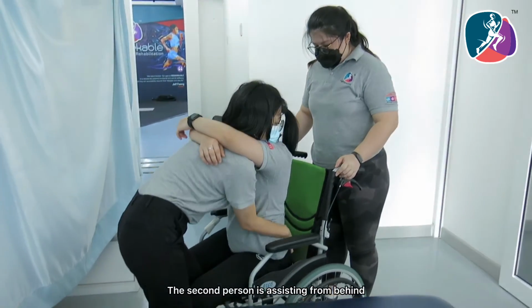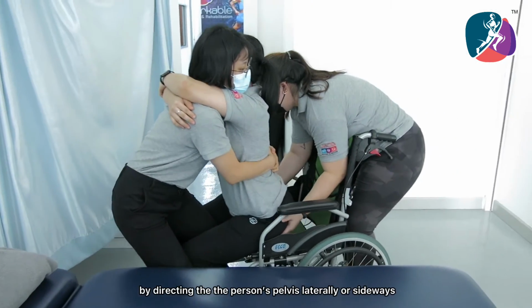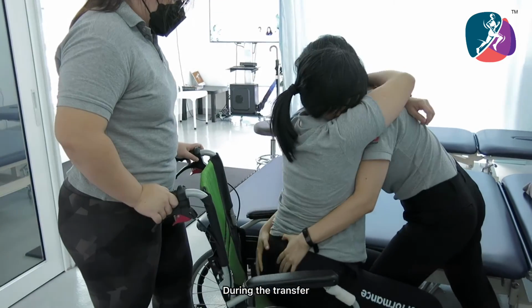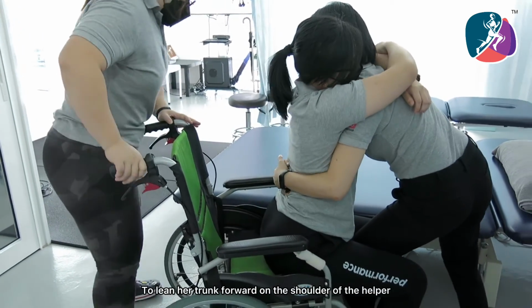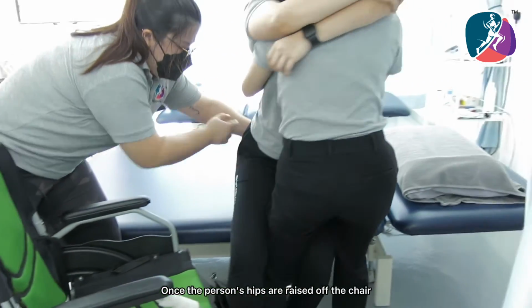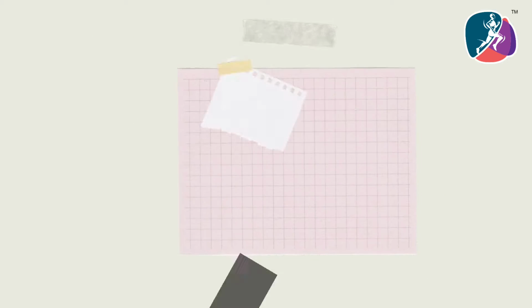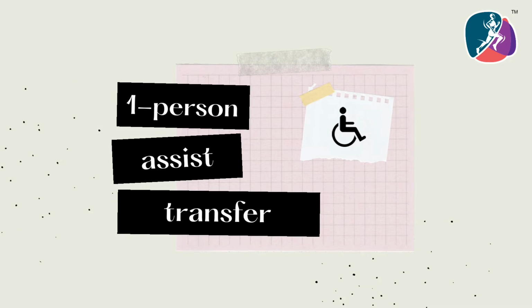The second person is assisting from behind by directing the person's pelvis laterally or sideways during the transfer. Instruct the person to lean her trunk forward on the shoulder of the helper. Once the person's hips are raised off the chair, you can pivot or turn with the person to assist her towards the bed. Next, one-person assist transfer.